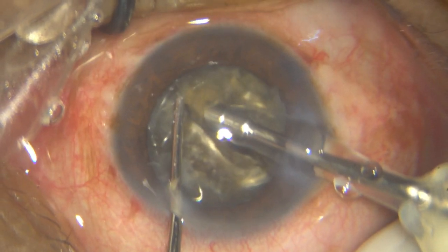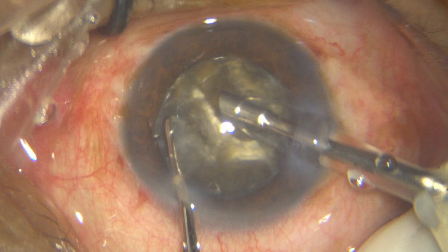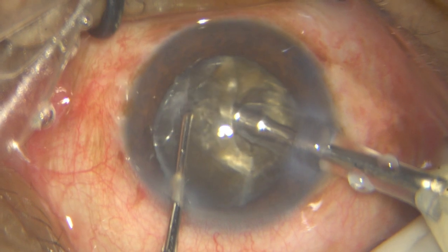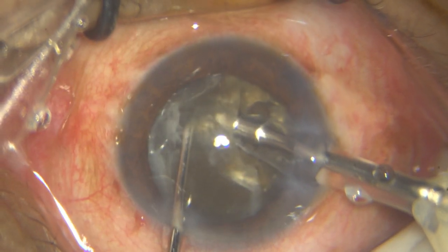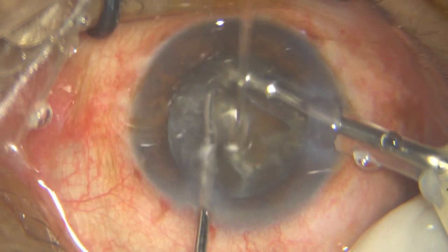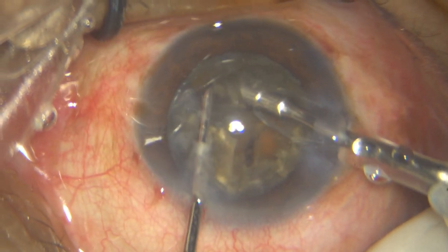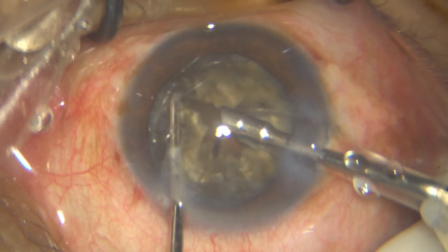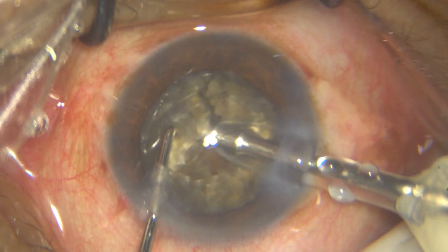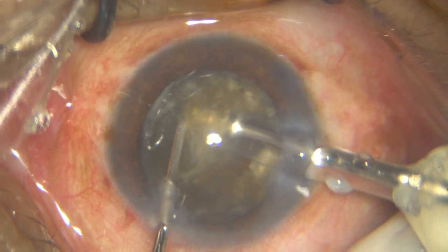Just keep going around. Look, I have just finished only one heminucleus. I'm not panicking. I'm not coming out. I just keep rotating. Now I will target the other heminucleus as well. So go into the depth. These nuclei are very thick anteroposteriorly, so you can go into a lot of depth, and you will need to do a multi-level chop because this is only a 1.5 mm or a 2 mm chopper, not more than that. And that thickness of that nucleus in the center is around 4.5 millimeters. So you really need to do a multi-level chop.